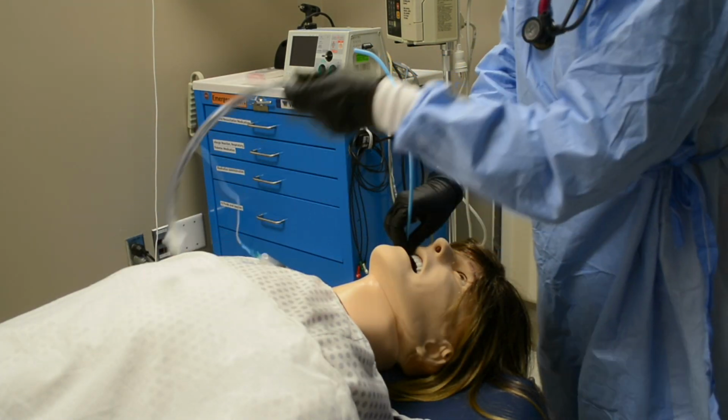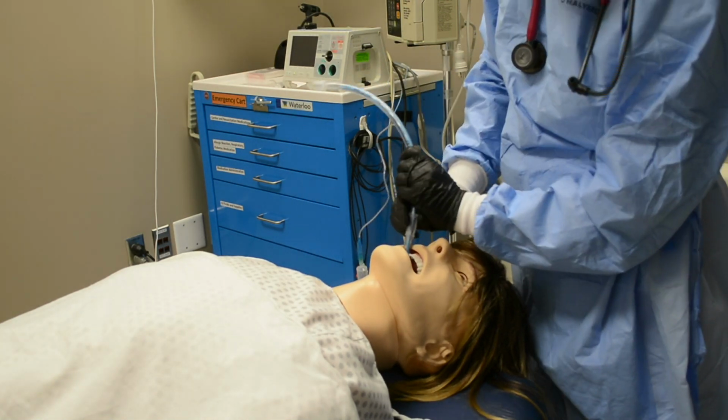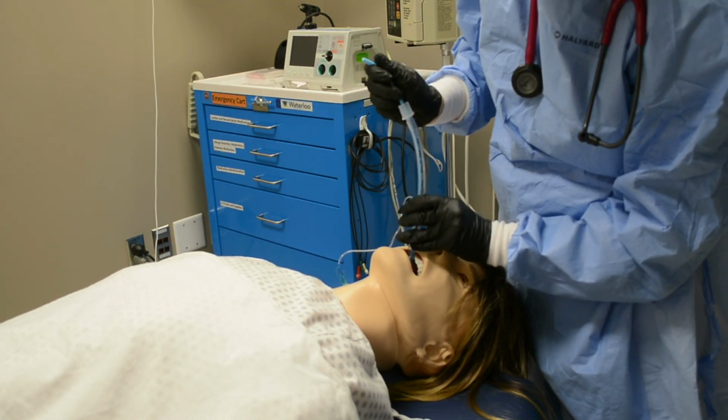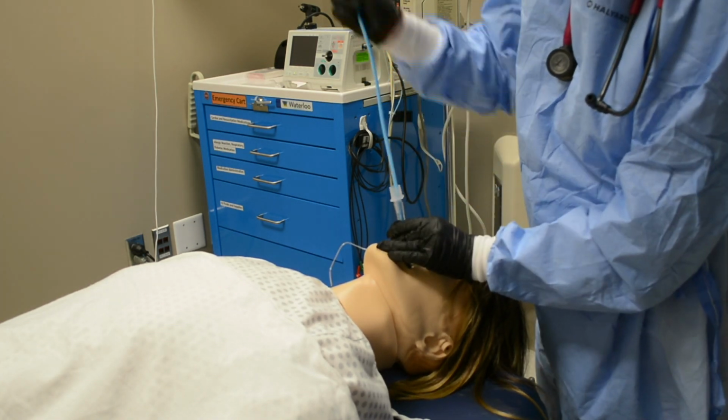Badness and bougie, holding up here like a doozy. Mallampati scores of 4, we got OSA and obesity too.